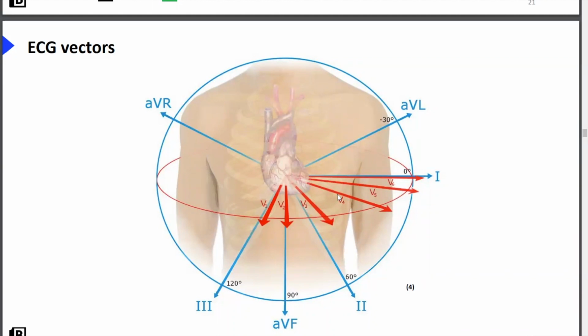So we've got septal, inferior, anterior. So it's anterior septal, kind of the same thing. It's not inferior. These leads are not pointing downwards. They're pointing out of the screen, okay? They're pointing anteriorly. V1 to V4 measures the flow of current anteriorly. So if you have a defect in these leads, that means the problem is in the anterior part of the heart.